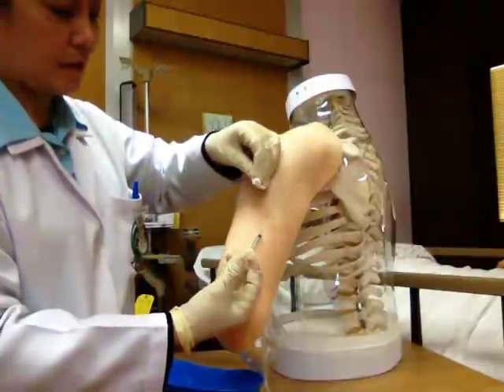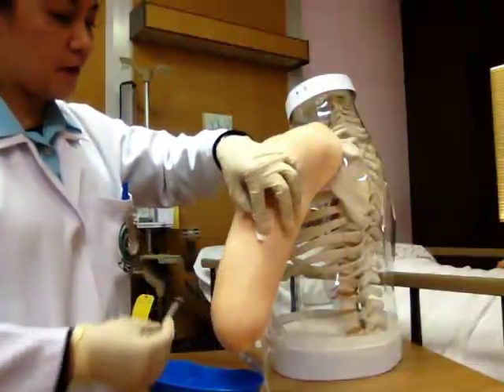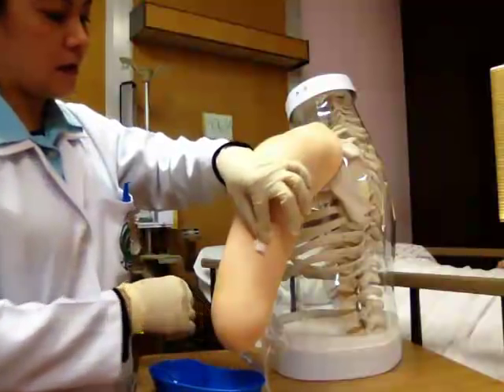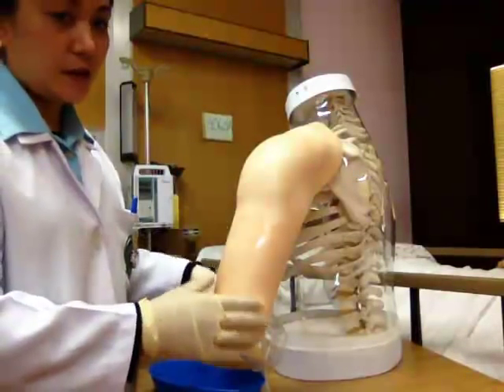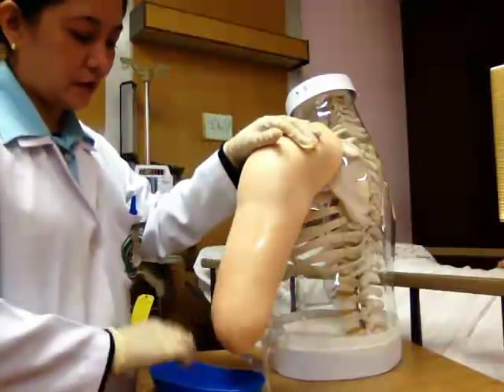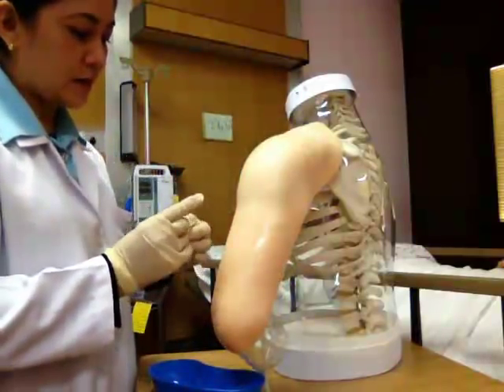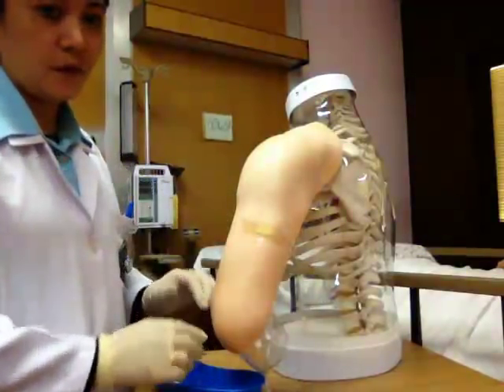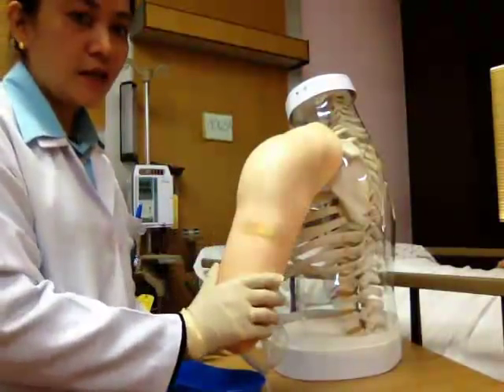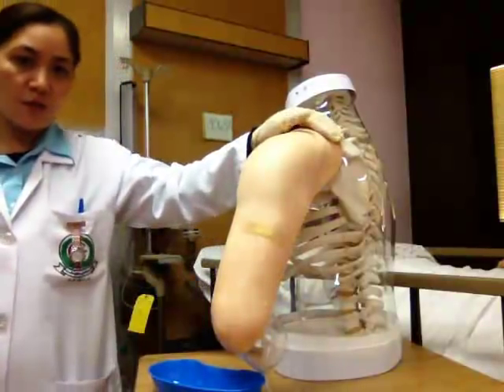Okay, that is a 45 degree angle. Then remove it and gently rub or massage the patient's site of injection. You can also place the band-aid on the injection site. Okay, so that is how to give a subcutaneous injection to our patient.